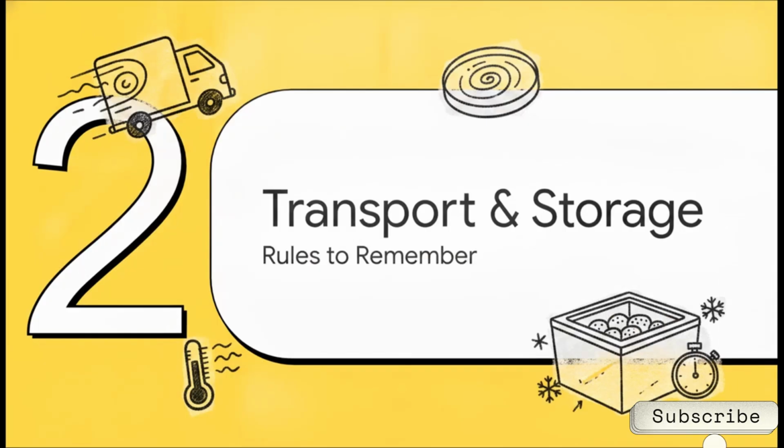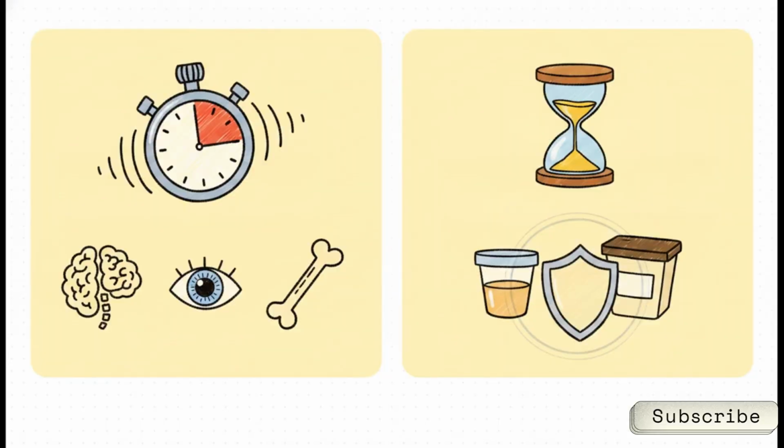Moving on to part 2, transport and storage rules. Okay, so test makers love to target transport rules with trick questions. You really need to notice the sharp contrast between urgent and non-urgent transport. First, you have specimens that demand immediate transport, meaning less than 15 minutes. This includes CSF, sterile body fluids, ocular specimens, and bone. You literally do not delay these, ever.